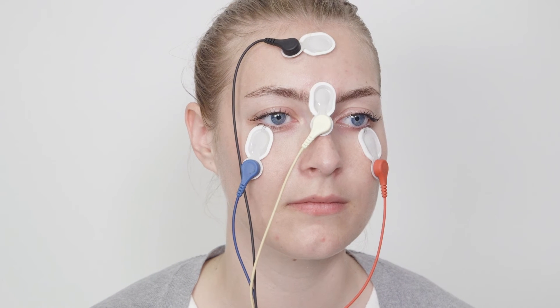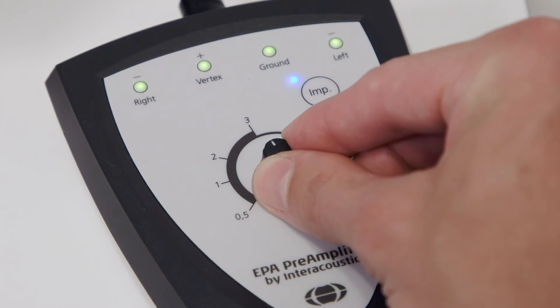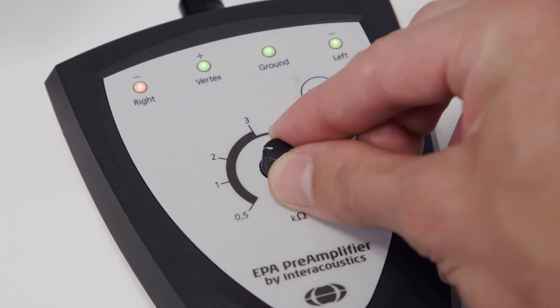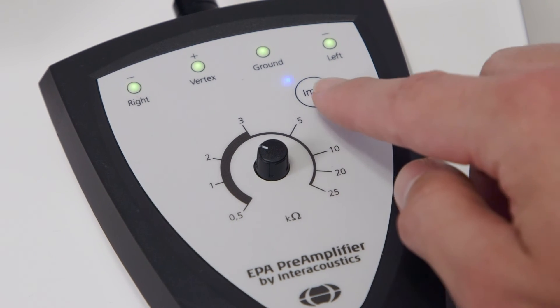When the cables are placed correctly, test the impedances. Impedances below 5 kiloohm are acceptable. It is important that there is no more than 2 kiloohm of imbalance in impedances between electrodes.